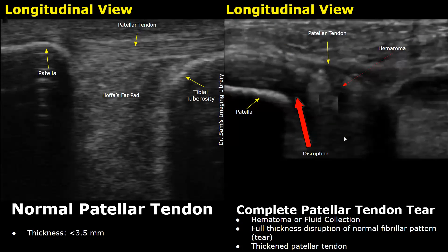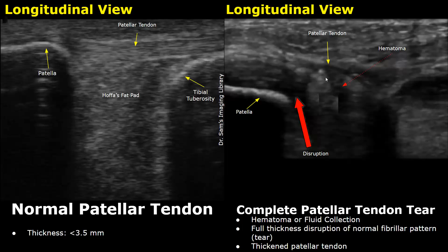Here is another image of a complete tendon tear. There is a full thickness disruption at the rupture site, and it is surrounded by heterogeneous areas representing blood collection or hematoma. This full thickness disruption indicates a complete patellar tendon tear.